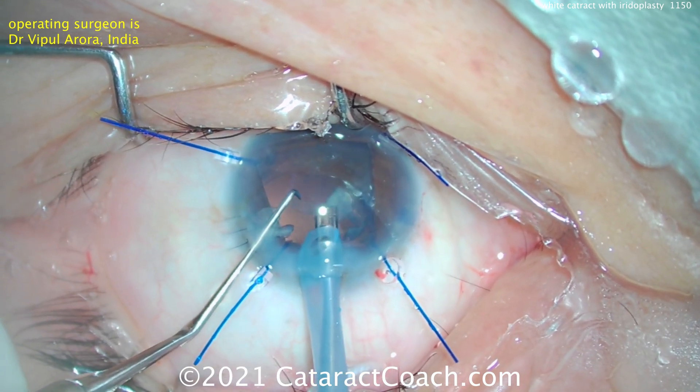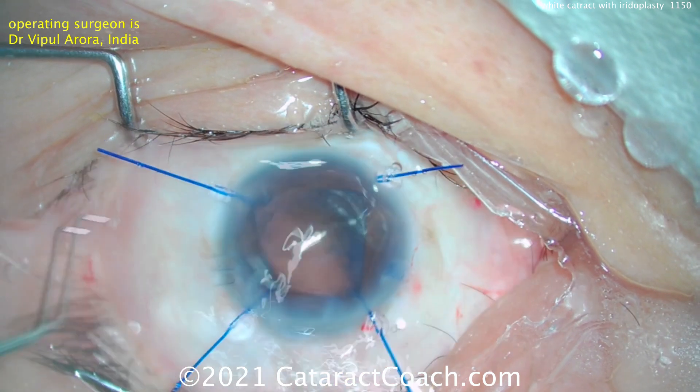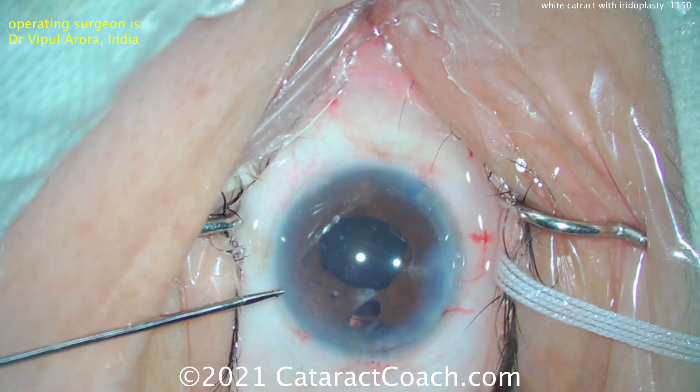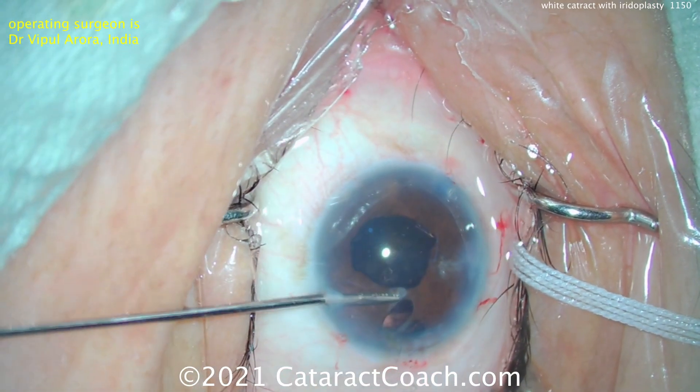I also like the use of iris hooks here. In this case, iris hooks are a better choice than putting a ring in the eye because that iris is already damaged and you can't really count on that. There's the lens in the capsular bag.